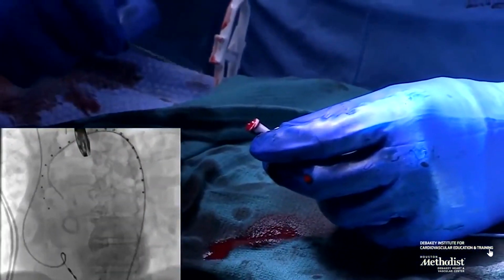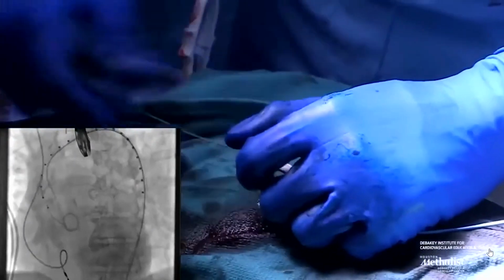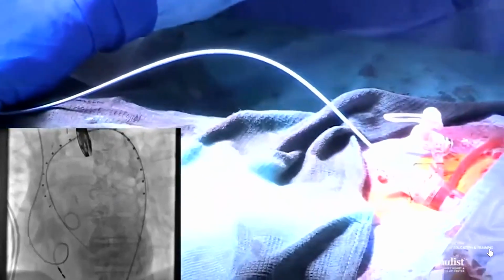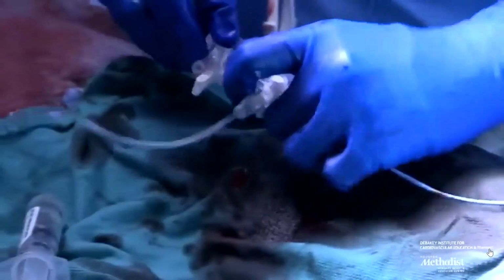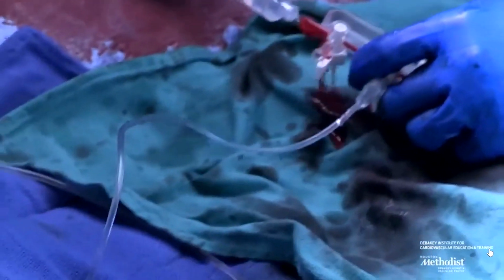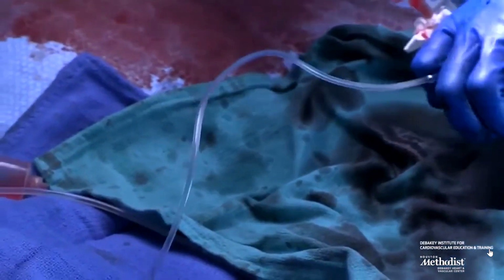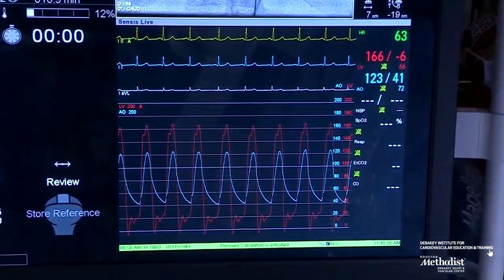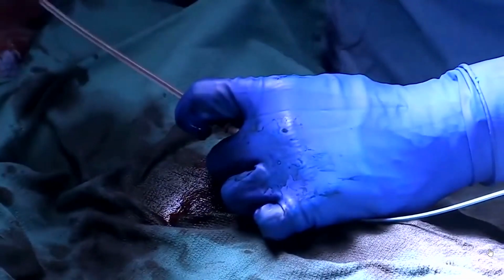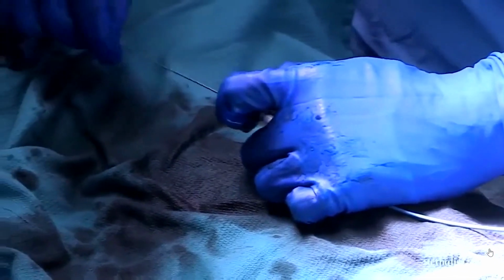You can see that pigtail in the non-coronary sinus, and then through the sheath, the 18 French sheath on the right side, we're going to put an AL1 catheter and a J wire and put it into the aorta so that we can cross the valve. You cross the valve, and then you do hemodynamics, and that way you can measure pressures inside the ventricle and pressures inside the aorta, and the difference in pressure between the aorta and the ventricle, that's your gradient. And then you can look at the end diastolic pressure and the left ventricular end diastolic pressure, and those should be the same at the end of the procedure.